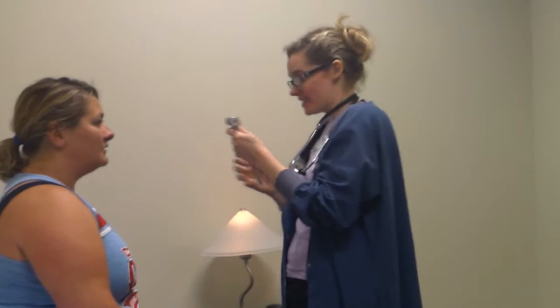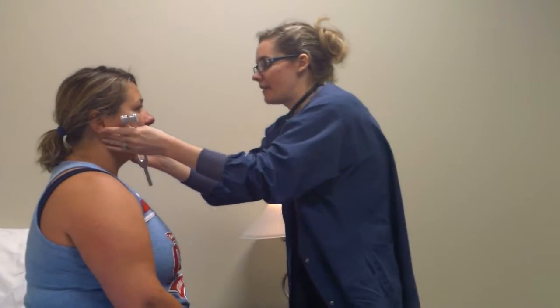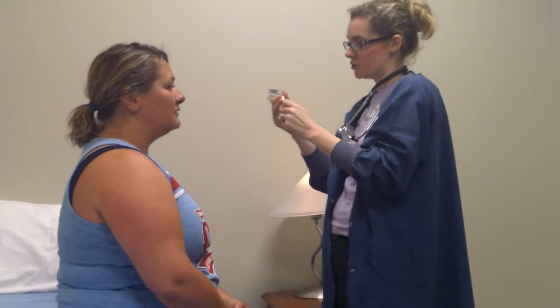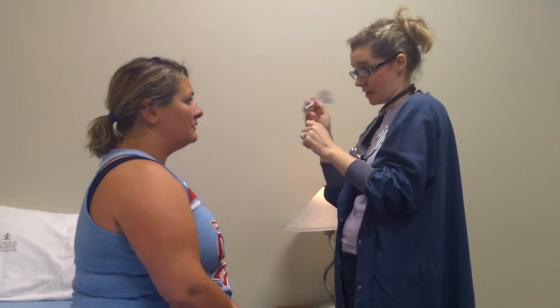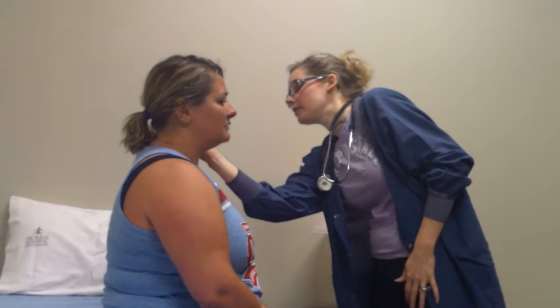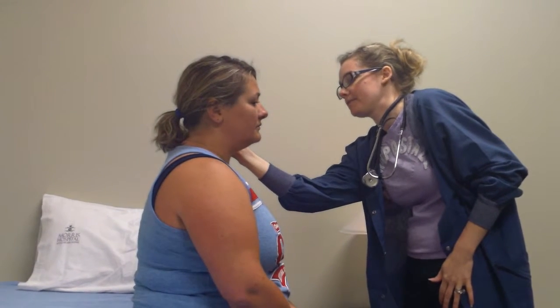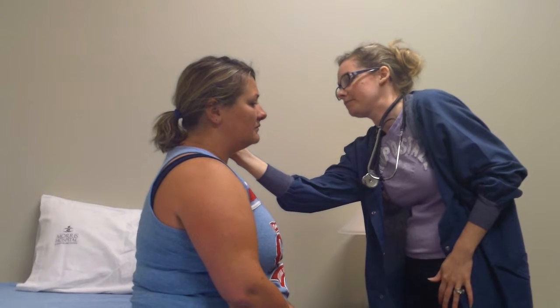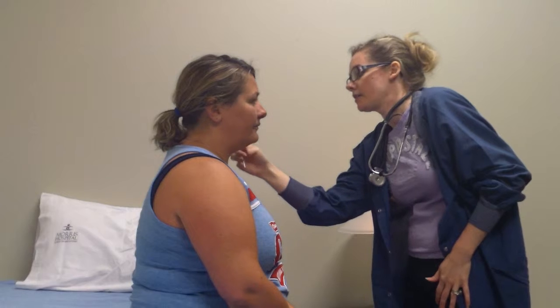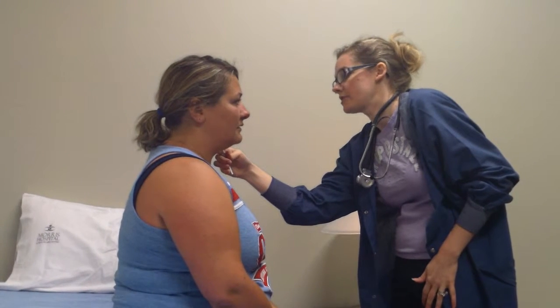Okay, the next thing I'm going to do is put it, do you have any pain in the mastoid process here? No. Good. What we're going to do is check the vibrations on this. I'm going to put it on the mastoid process. You tell me when you stop hearing it, and then we're going to put it in front of your ear, and then you tell me when you stop, okay? Can you feel the vibration? Mm-hmm. So tell me when you don't hear it anymore, or feel it. Can you still hear it? Yes. Tell me when you stop.